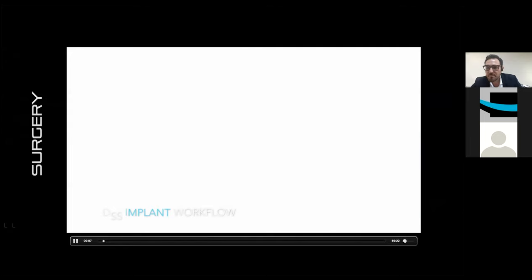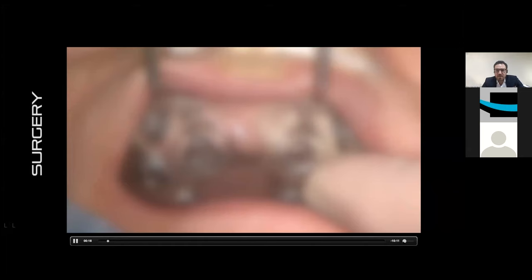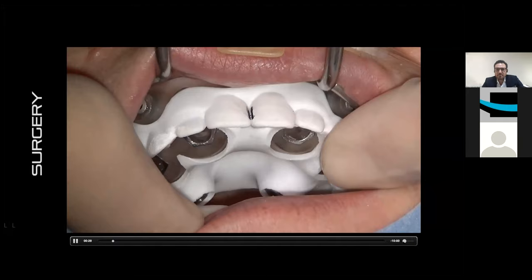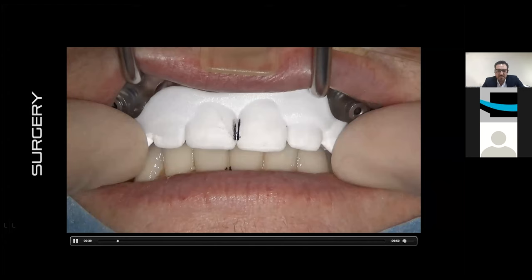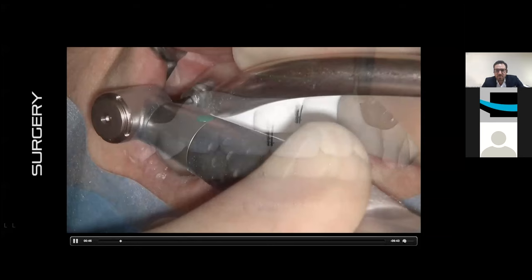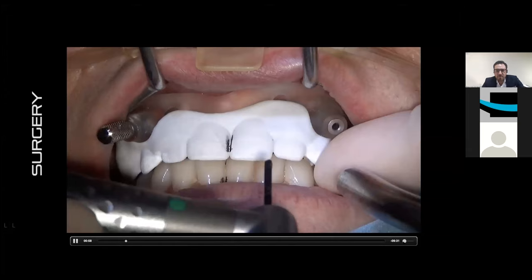Okay. As already indicated, it's essential to position the template correctly. The presence of the rigid index represents a very large advantage. As we show, the most important moment is when we position the anchor pins. Anesthesia will be performed exclusively in correspondence of the alveolar mucosa and well in advance before positioning the template in order to minimize the possibility that the infiltrated soft tissue can displace the template itself.